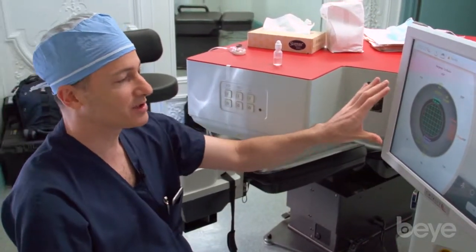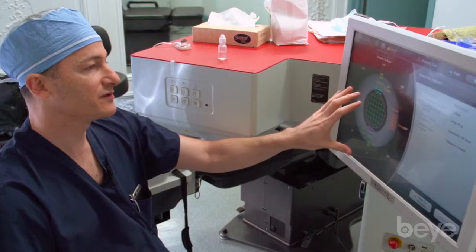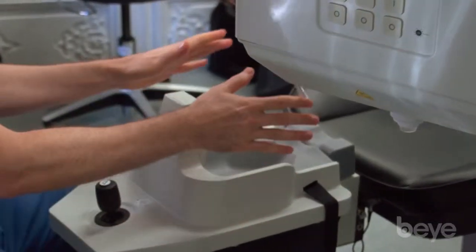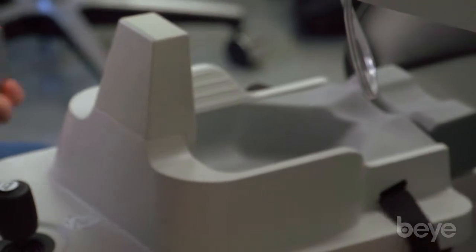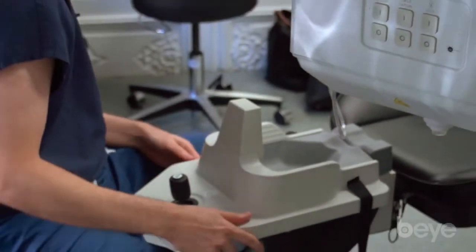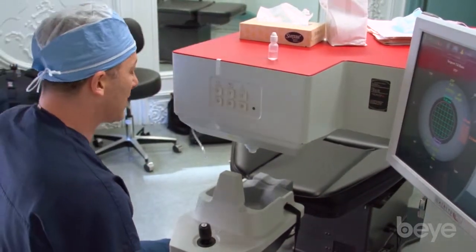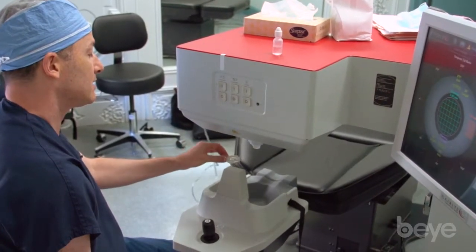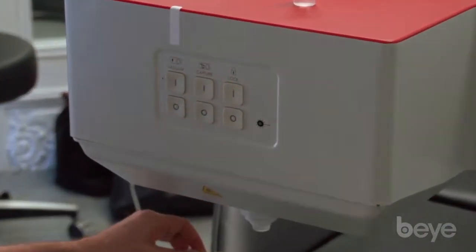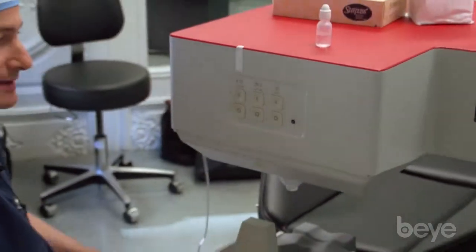It's a beautiful user interface — it presents the surgeon with everything needed to perform the surgery. We confirm, perform a surgical timeout, and once everything is approved we move on to the patient. The patient is made comfortable on the moving bed, and once the head is positioned we use pillows and cushions to stabilize it while programming. The bed is then brought underneath the laser, and using three simple buttons — vacuum, capture, and lock — we confirm the patient's eye is in line with the laser and proceed. That completes the walkthrough of the Catalyst femtosecond laser system.